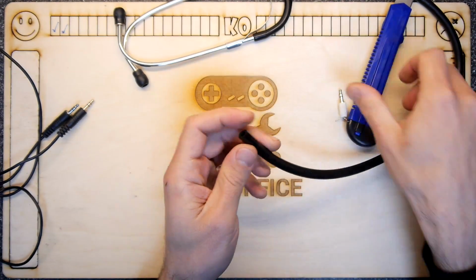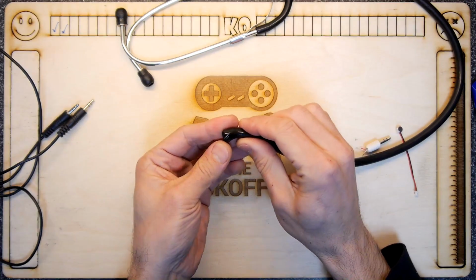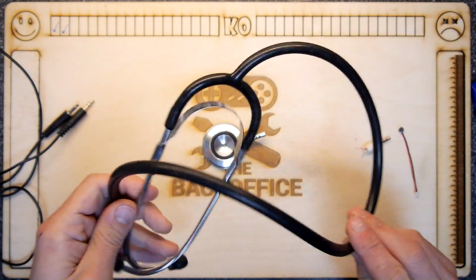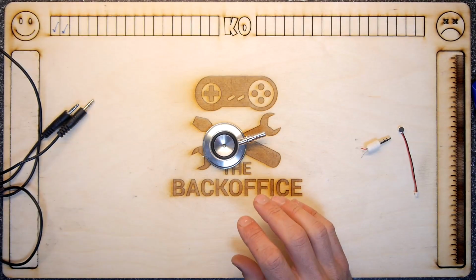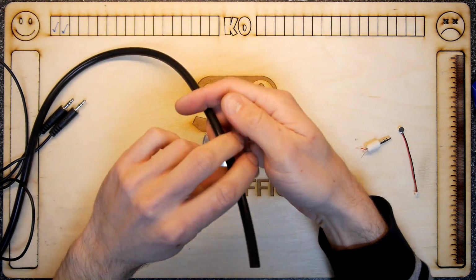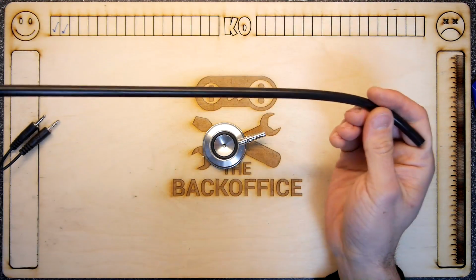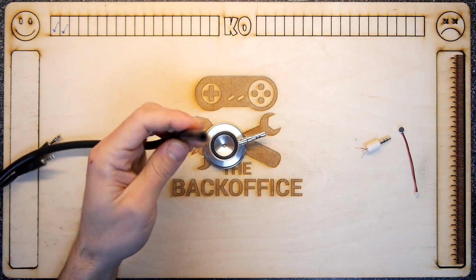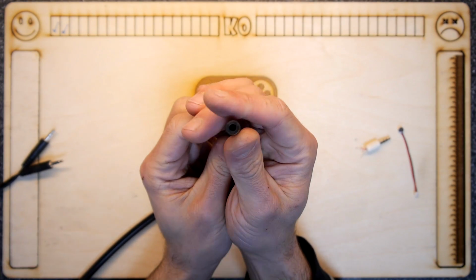So you might reuse this tube actually. We'll need to reuse some of this. It's a shame you have to cut it. You'll decide whether or not you want to keep this part. You can bin it if you want. Now I've actually got some other silicone tubes. I don't want to keep making my stethoscope tubes shorter, but use the tube off your stethoscope, or if you've got some spare silicone tube, again, you've seen that in my previous videos with a suitable inner wall.